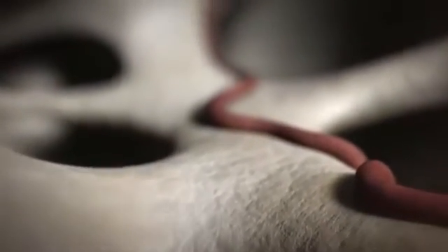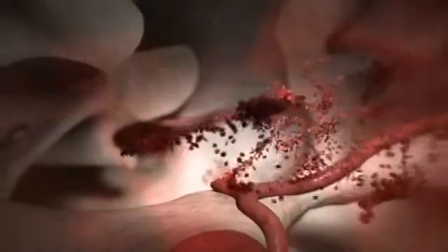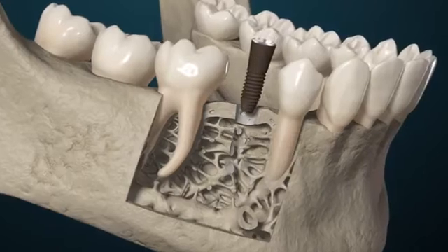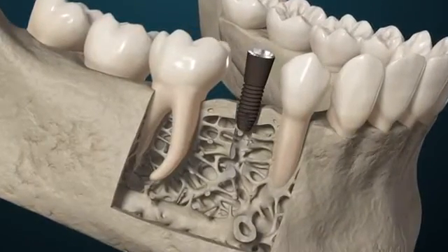Sometimes, however, the unexpected happens. A drill intrudes and destroys the naturally sculpted bone. Blood vessels are torn and a major defect is created, quickly filling with blood. The titanium implant is inserted where the tooth was previously lost. At first, the only force holding the implant in place is mechanical friction — this is called primary implant stability.